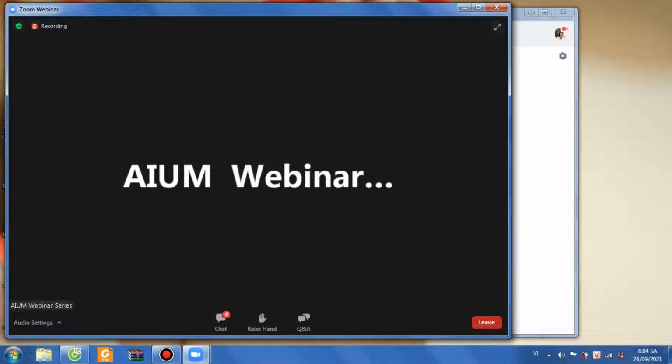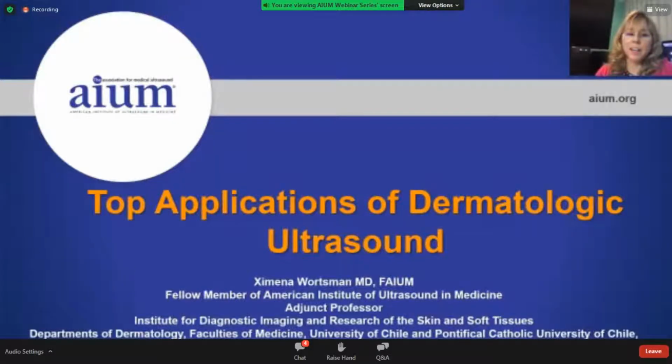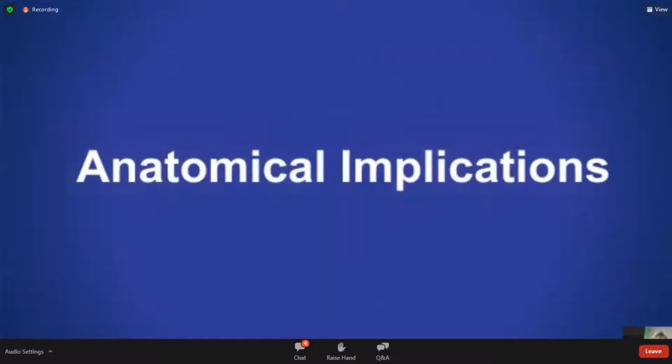Hello everybody. It is my pleasure today to share this lecture on the top applications of dermatologic ultrasound. First, we will talk about the anatomical implications, and then we will move to the main applications of ultrasound.